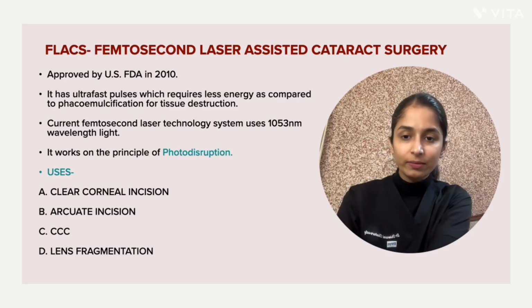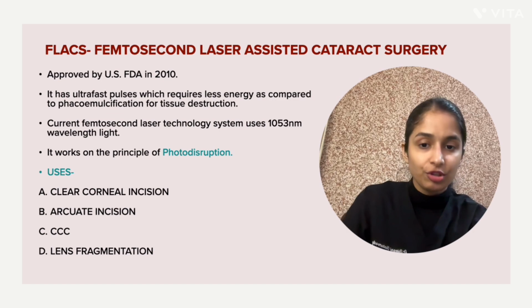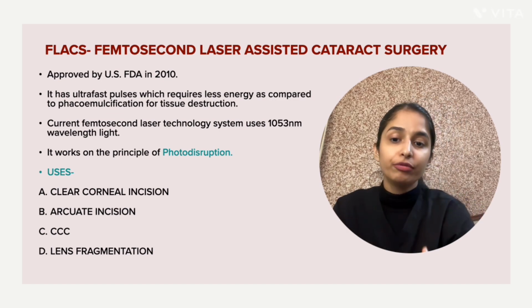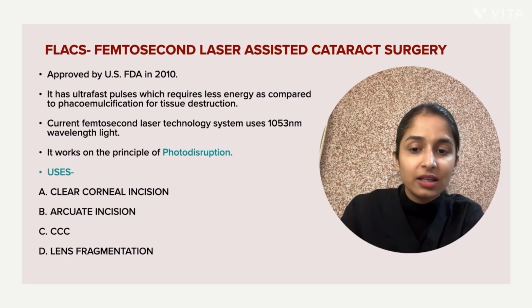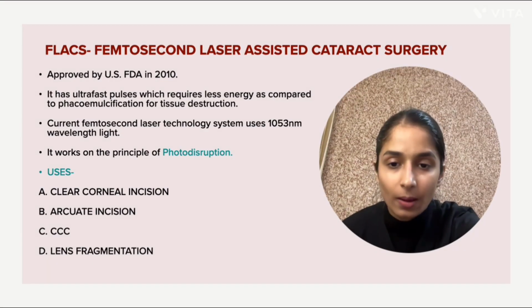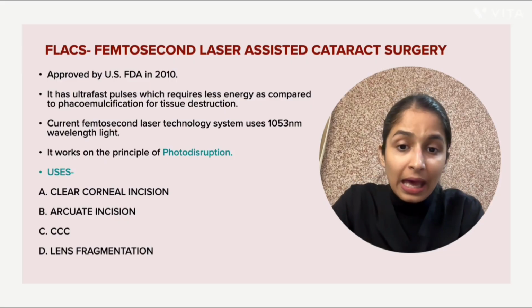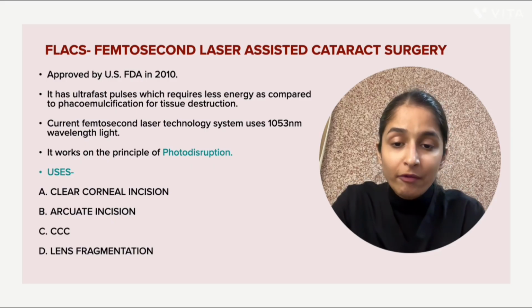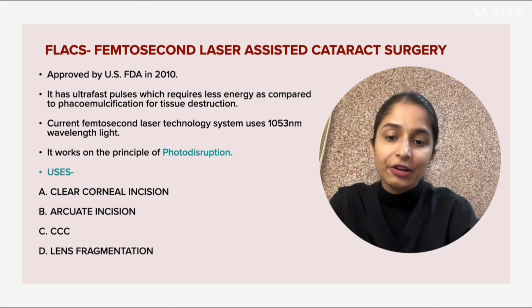Moving on from traditional phacoemulsification, we arrive at the latest evolution, that is FLACS, femtosecond laser assisted cataract surgery. The FDA approval of FLACS in 2010 introduced a new level of computer guided precision to the operating room, and the magic behind this technology is the femtosecond laser, which works on the principle of photodisruption. Now, the laser automates several critical steps in cataract surgery, and the first one is that it creates an incredibly precise multiplanar architecture for the main entry wound, which helps to seal it better. It is also used to correct pre-existing astigmatism during the cataract procedure.